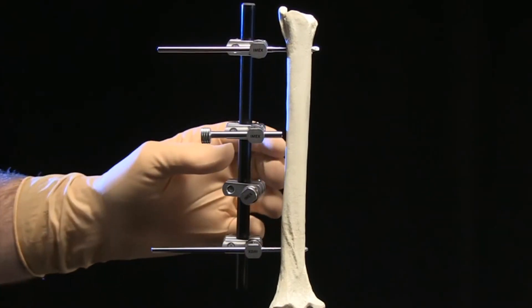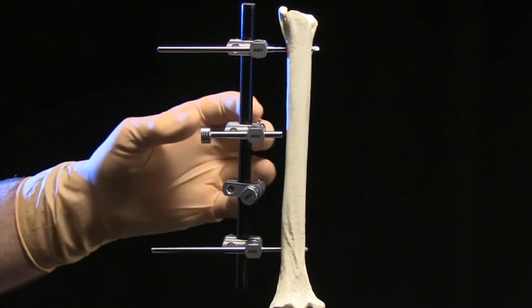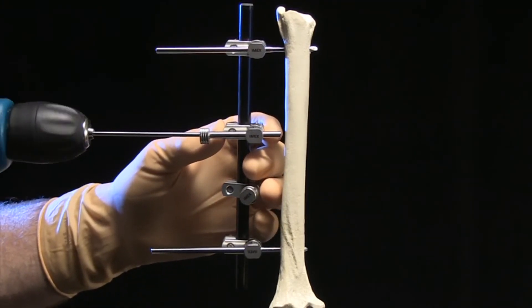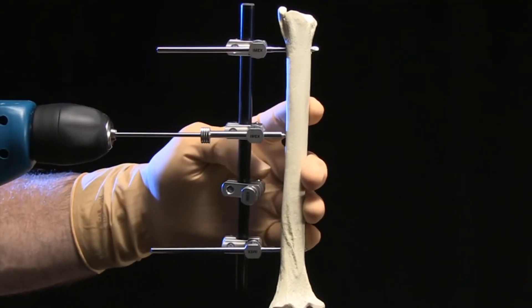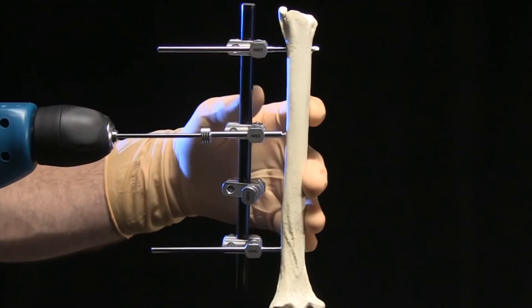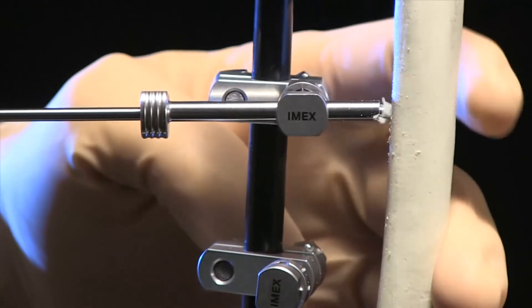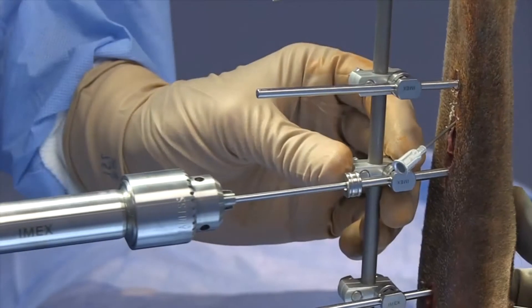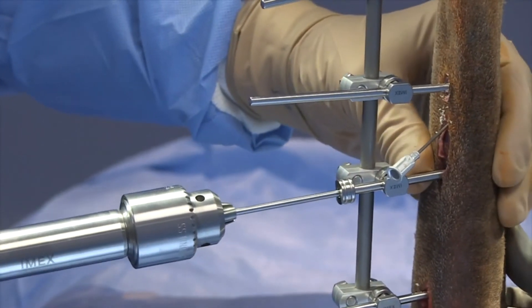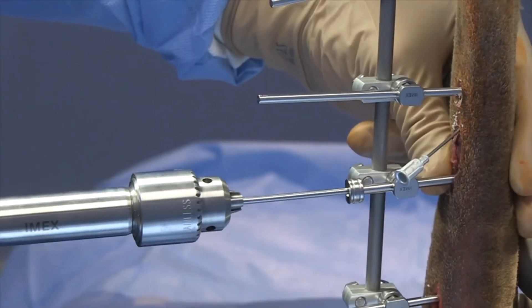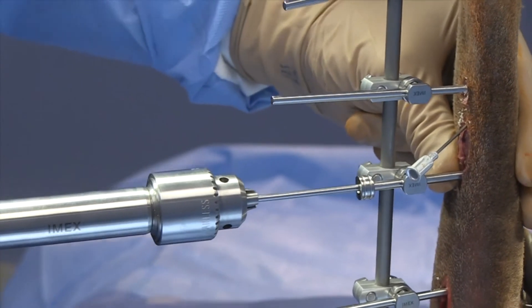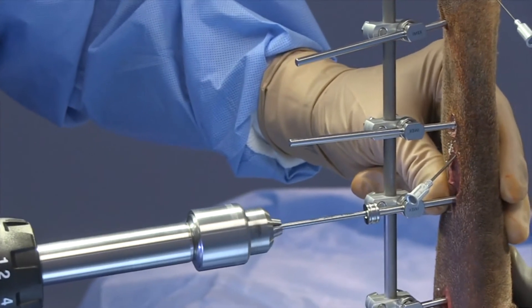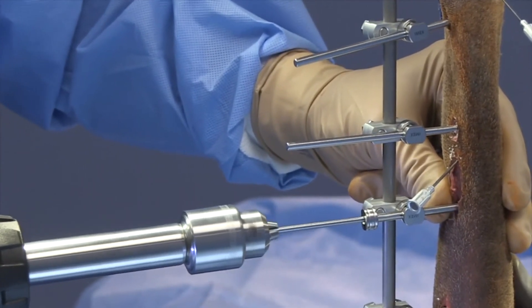Most frames constructed are predominantly half-pin frames, and no attempts to place pins in the same plane are made. Instead, pin plane and position are determined by the best bone target or by the least soft tissue impingement. In effect, the SK clamp and secondary bolt, when appropriately used, behave as an extra pair of hands to simplify application of the fixation frame while eliminating the need for additional aiming instruments.